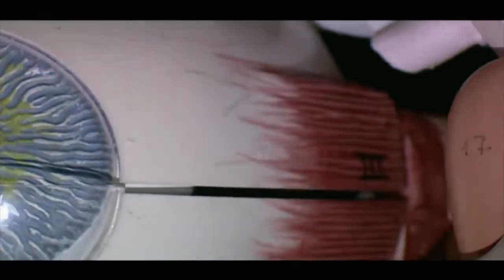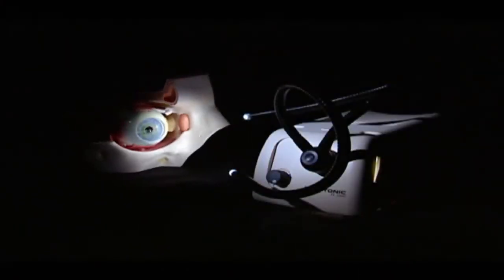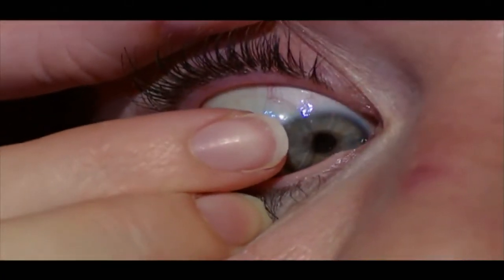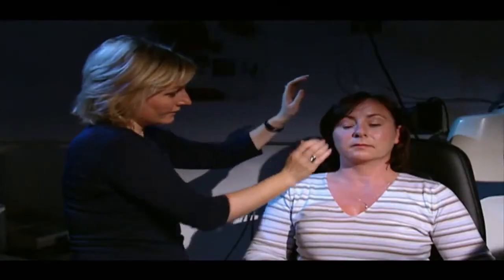The problem lies with the biology of the eye. The cornea is the only part of the human body that has no blood vessels. That means to stay healthy, it needs constant contact with air. Cover it up, and the cornea will fall prey to infection, and that could cause blindness. So, Bausch & Lomb have come up with a range of porous lenses that let air reach the eye.